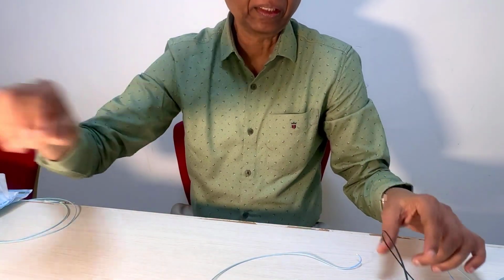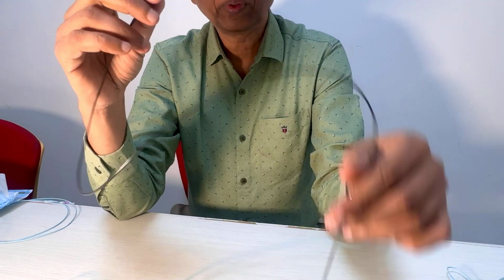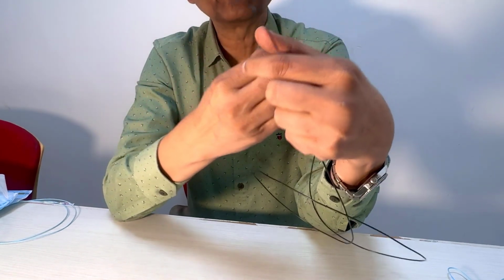But when you're coming transradial to do visceral work, this is the catheter that you use. This is a catheter made by Terumo. It's probably one of the best catheters. Merit is another company that makes it. The important thing over here, if you look at the length, it is 125 centimeters. It's actually 135 centimeters, and it takes a wire.